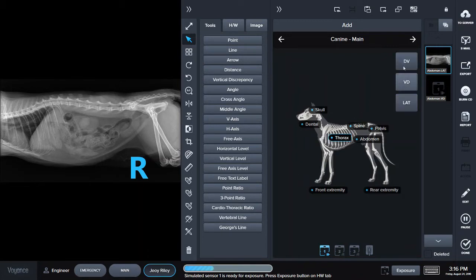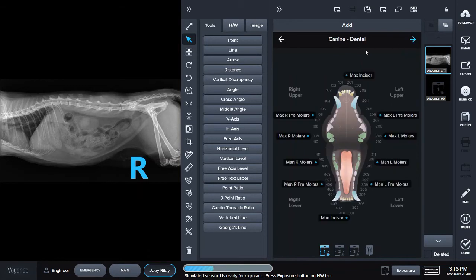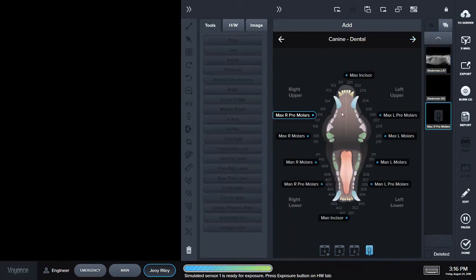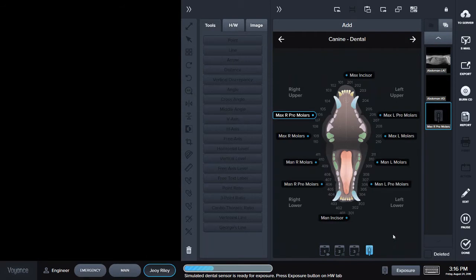I can add additional views and I can also add dental x-rays. If I add a dental x-ray, the system automatically detects the dental sensor, so I do not need to do that manually.